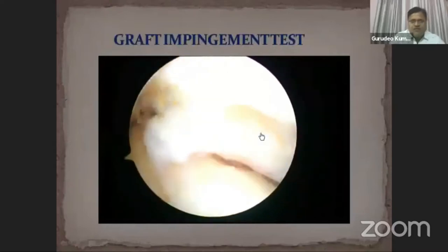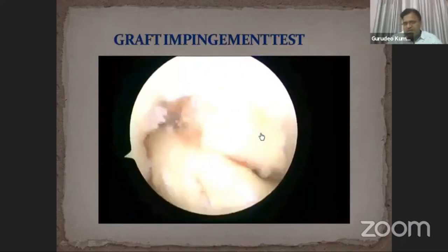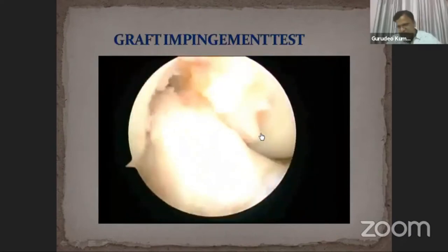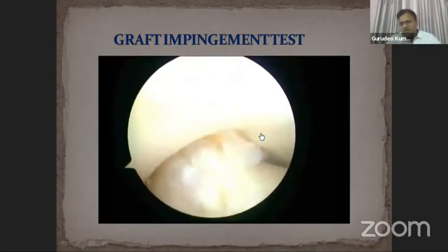We then check for graft impingement during complete knee extension and flexion. You can see here that during extension there is no graft impingement at the roof.